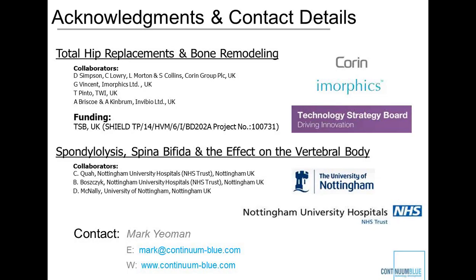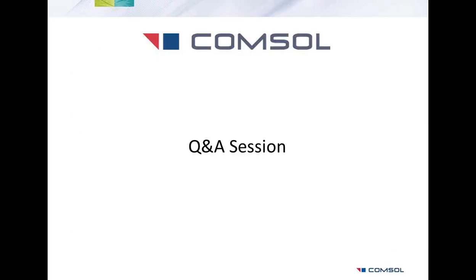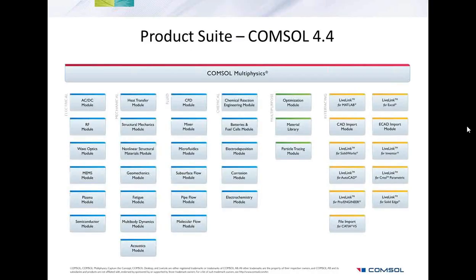Yeah, so thank you so much, Mark, for your presentation and demonstration. So, yep, it's time for the question and answer session. The first question that we have today for you, Mark, is how long does it take to perform a complete bone remodeling analysis? And typically, what kind of hardware are you using to run this analysis?